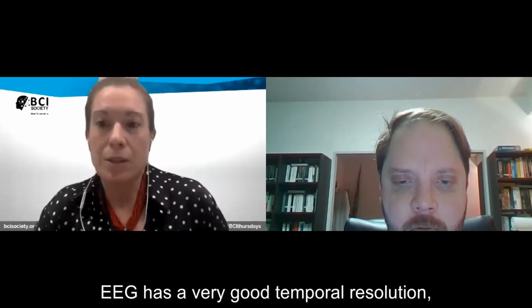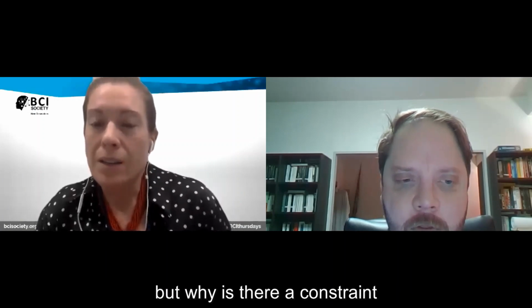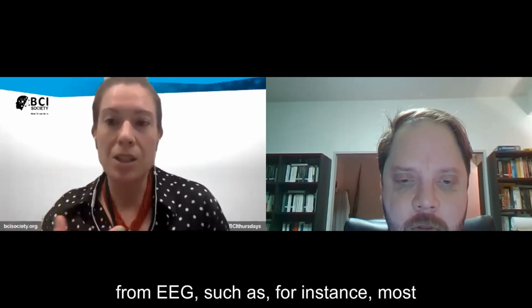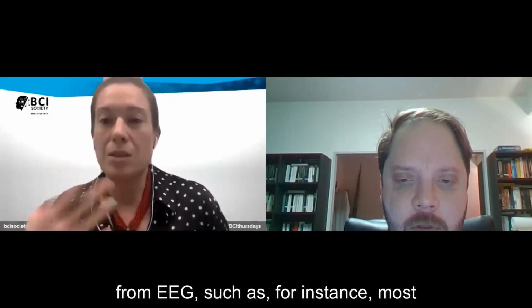EEG has a very good temporal resolution, but why is there a constraint on the reliable spectral information we can extract from EEG, such as, for instance, most of the literature discounts anything above 60 hertz?